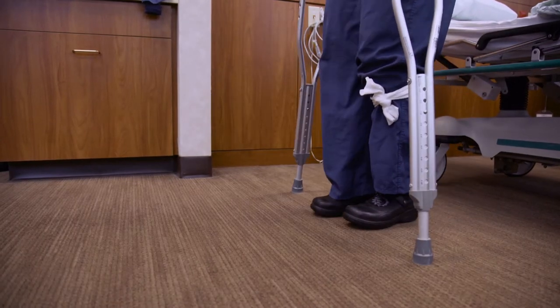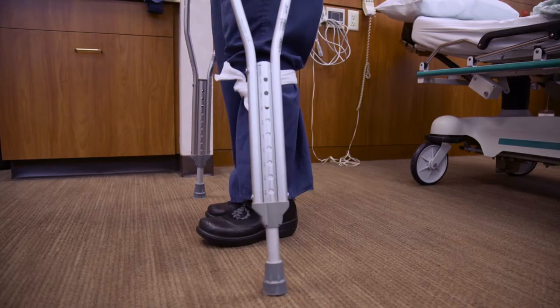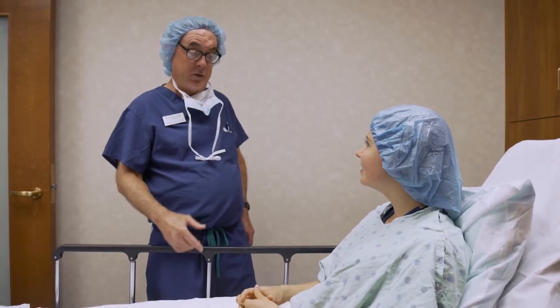For partial weight bearing, plant your crutches and place a little bit of weight on your surgical leg, using the crutches for balance. Take a step and bring your good leg through. The type of surgery you have will determine if you are to walk non-weight bearing or partial weight bearing, and will be specified by your surgeon.